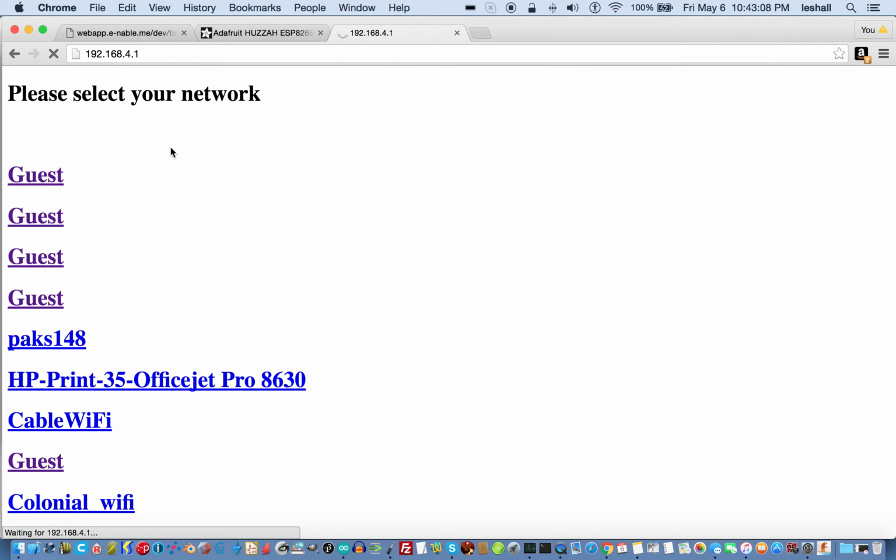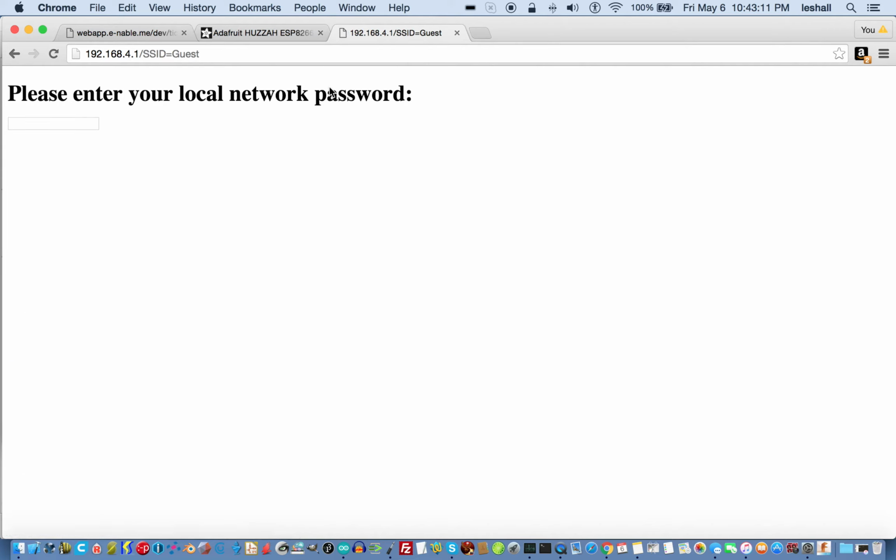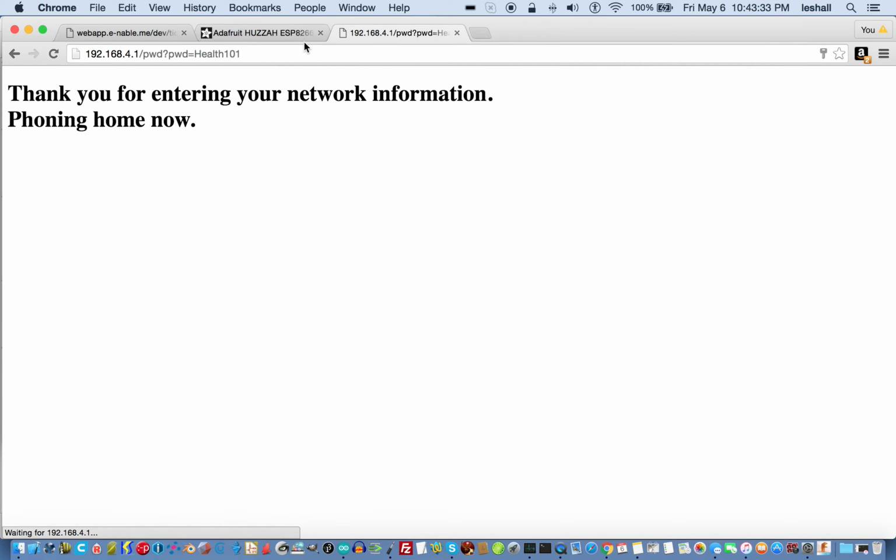Now it will serve us up another web page. Here, please enter your local network password, and I will do that now. Okay, hit enter. And, well, you can see what it was right up there. Thank you for entering your network information, phoning home now. We gotta make this hidden. This is a no-no. Okay.